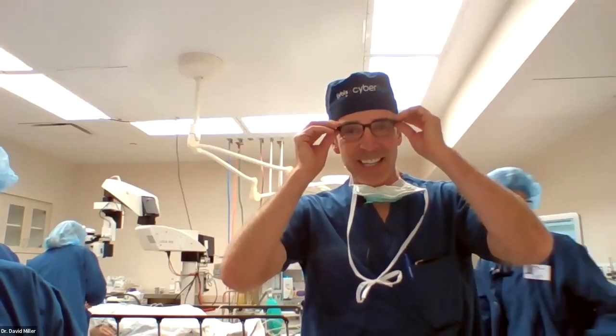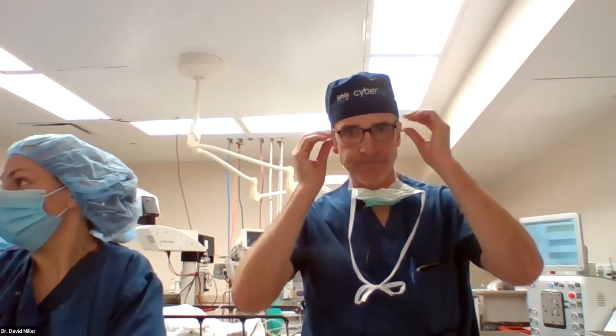So the next case is a little more involved. We have an eye with multiple surgeries from an outside surgeon. It was referred in from the outside. They had three retinal detachment surgeries, oil in the eye. The oil needs to come out, and there's a big membrane across the macula. So we're going to try and peel that. So I'll go through a few of the questions and answers here.